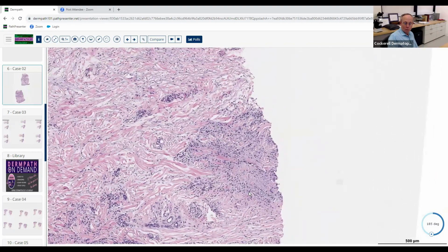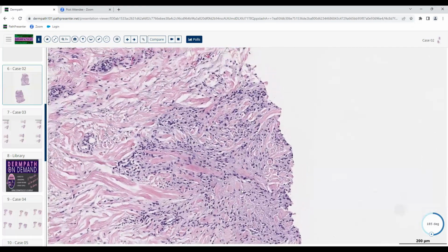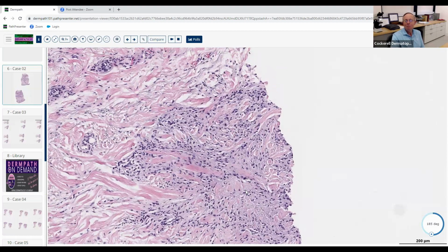Okay, so very good. Now you said they almost look like they are palisading. Is it possible that they just absolutely positively are palisading around these? Yeah, so it's definite. Absolutely slam dunk, LeBron James. The ball goes right into the net and it falls off the rim. So this is a perfect, beautiful example of palisaded granulomatous dermatitis.